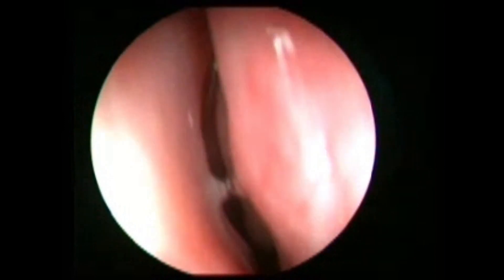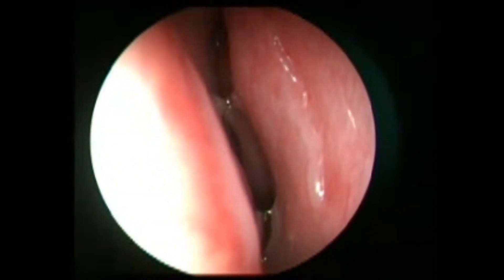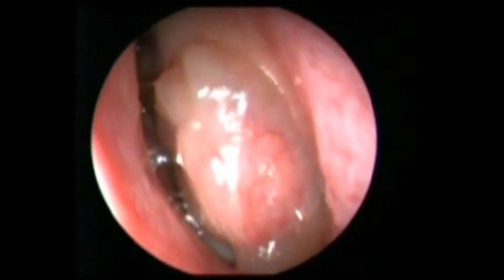Then we move on to a case of nasal polyposis. It is usually a bilateral thing with multiple pale, grape-like masses, and here you can see in the patient's left nasal cavity the masses are occupying the middle meatus.